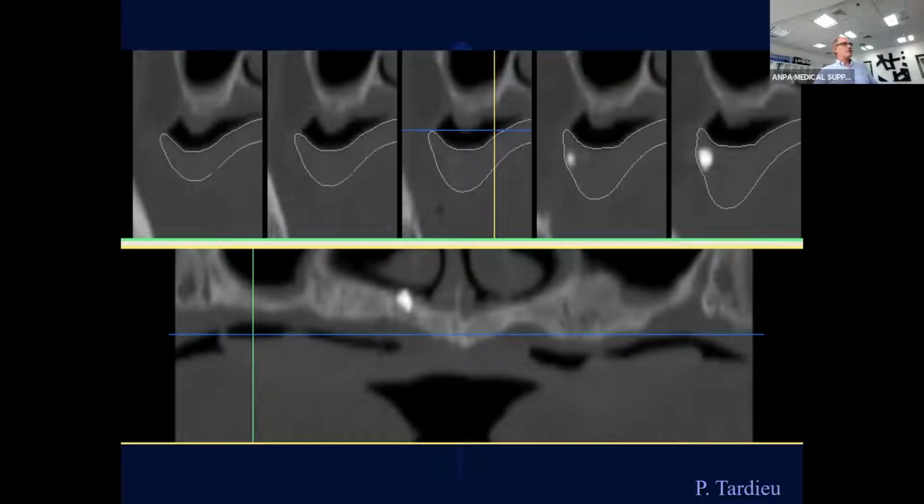we cannot fix it. So when you get your surgical guide, the surgical guide will not stay in the right position. So be very careful about that. First of all, if the denture is not stable, you need to realign the denture. And if the denture is in position, make sure that the position is stable and that the patient is biting on the cotton rolls in a good way. If you don't do that, you will have bad surprises at the time you place the implant. And this is a big risk of mistake.